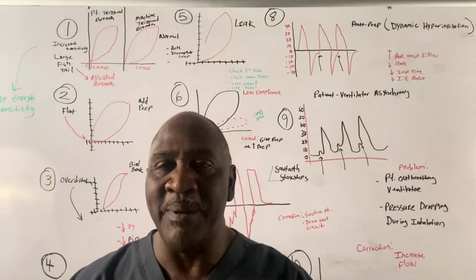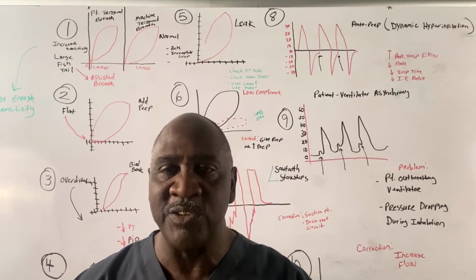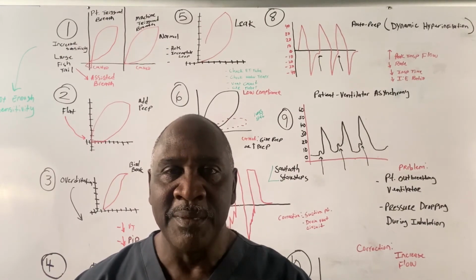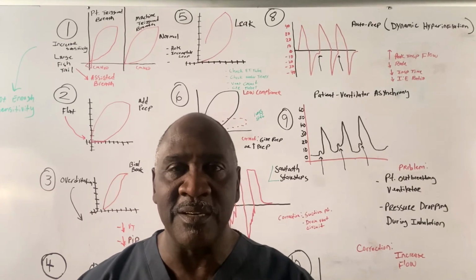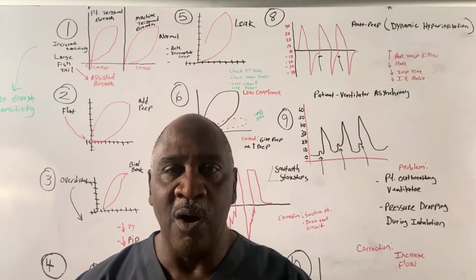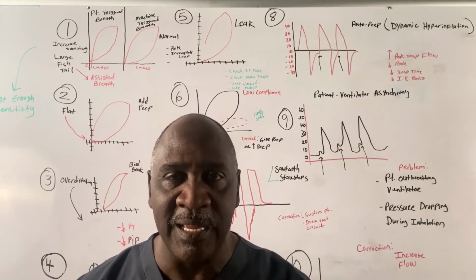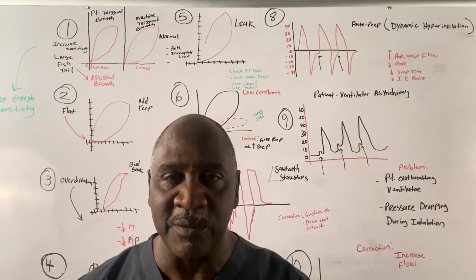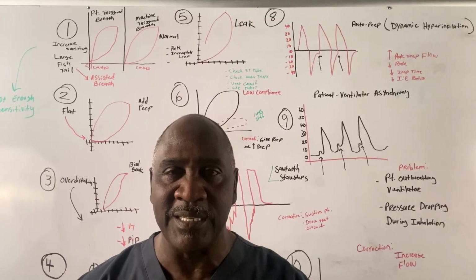Hey guys, I'm back. Well, there you have it. Ventilator waveforms essential for the TMC exam. Now, I can assure you that you will see a combination of these waveforms on the exam. First of all, recognition is one of the key things. Keywords is another key thing. And then just go for it in the correction. You will see a combination of these on every version of the TMC exam.